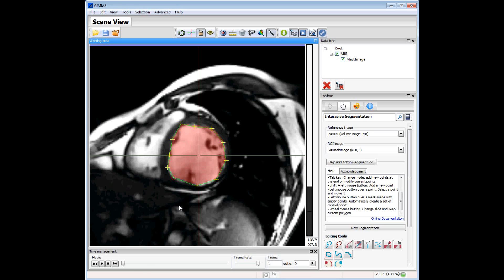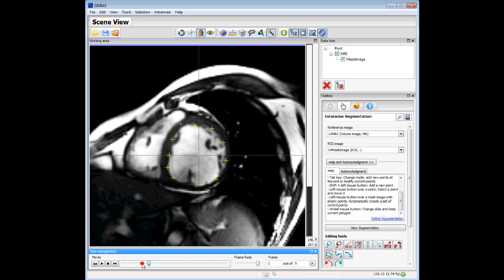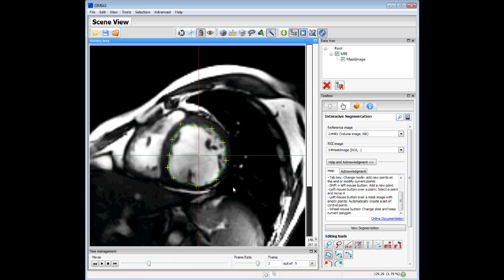We can now switch to another time step, and the control points are kept in the same position, so it is easy to continue the segmentation at another time point. We press left mouse button on the image and the polygon will be painted. We can adjust the control points again to the region we want to segment and press the Space key to paint the inner zone.